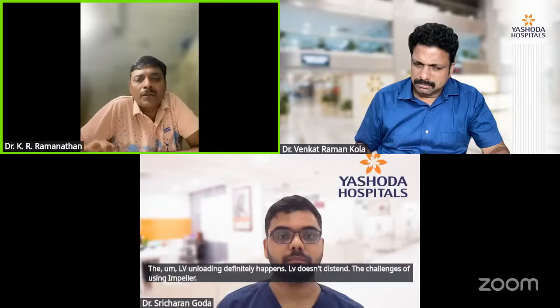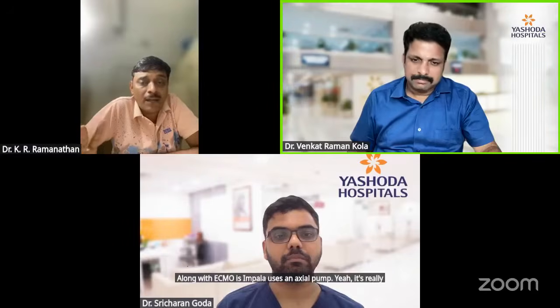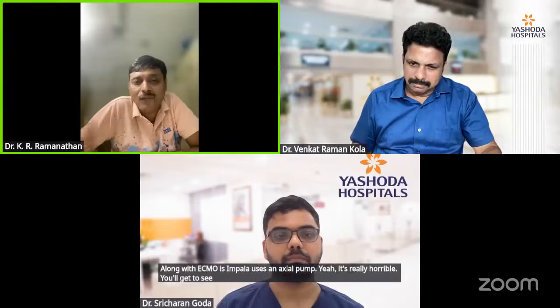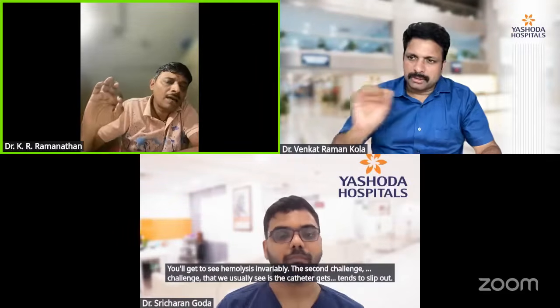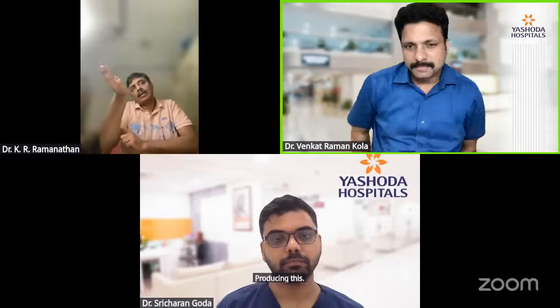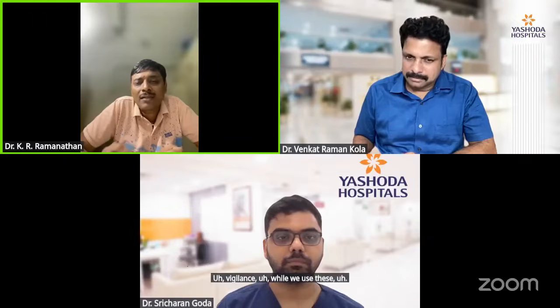The LV doesn't distend. The challenges of using Impella along with ECMO: Impella uses an axial pump, so hemolysis. Yes, it's really horrible. You'll see hemolysis invariably. The second technical challenge we usually see is that the catheter tends to slip out of position, out of the LV. It's very common that this happens, and we need to keep vigilance while we use these advanced devices.